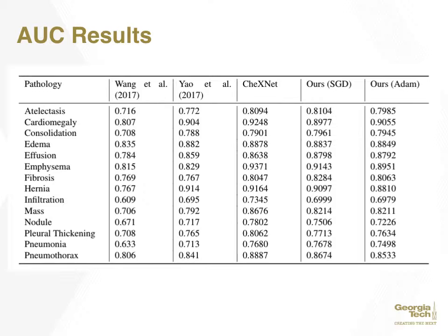Our best results were better than ChexNet for 4 of the 14 pathologies and close in all of the other cases. To our surprise, our results were better without random flipping. This could be due to a class imbalance. An improvement might be had by only augmenting underrepresented classes.